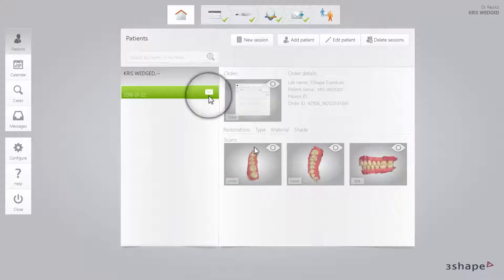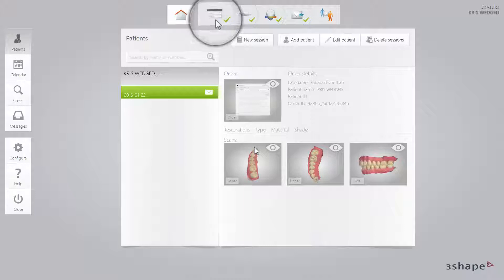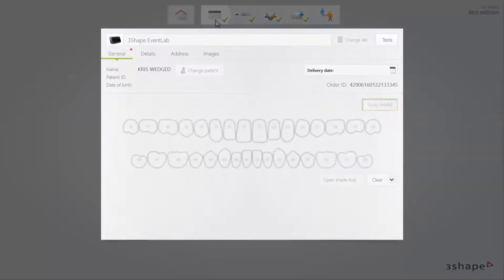First, select the existing sent case of the patient in the patient's window. It is marked by the envelope icon. Then select the order form window in the workflow bar at the top. You may notice that everything in this window is greyed out and cannot be modified. It is a safety measure implemented to avoid accidentally modifying the order.